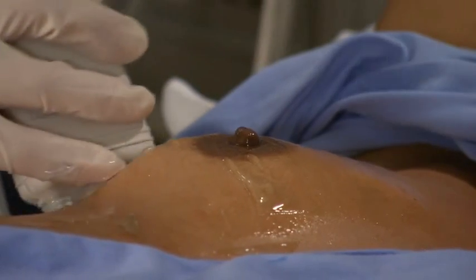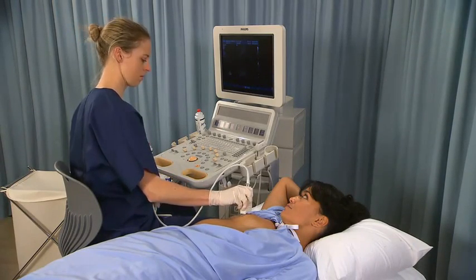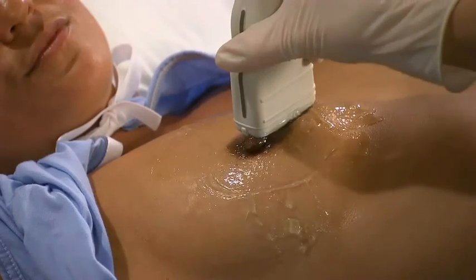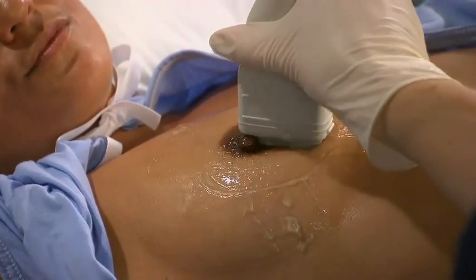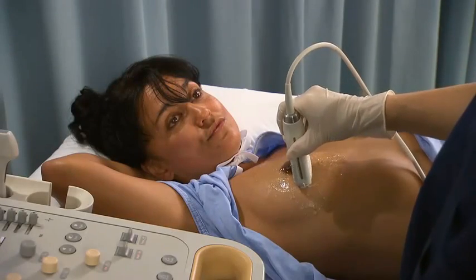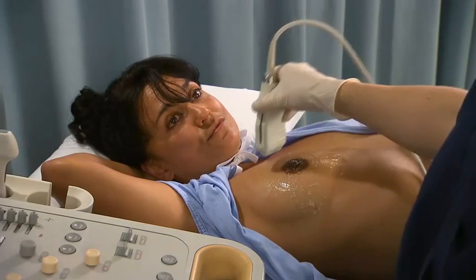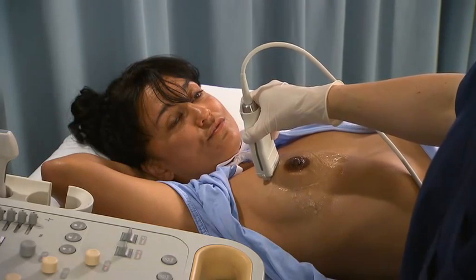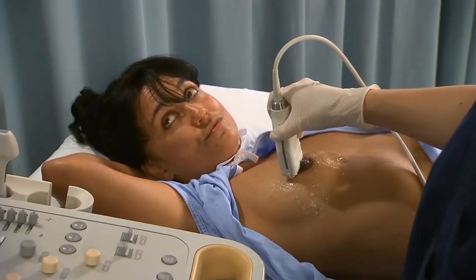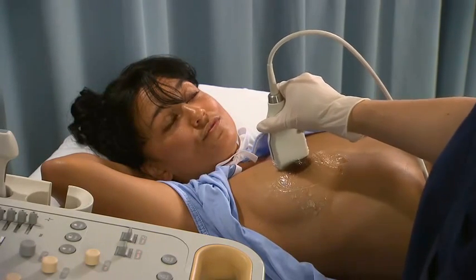Scanning the breast in the radial and anti-radial planes is exclusive to breast ultrasound. The radial imaging plane is arranged in a wagon wheel pattern with the nipple at the center. The radial plane is parallel to the ductal system and is extremely useful for detecting ductal lesions. The anti-radial imaging plane is oriented 90 degrees to the radial plane and perpendicular to the ductal system.